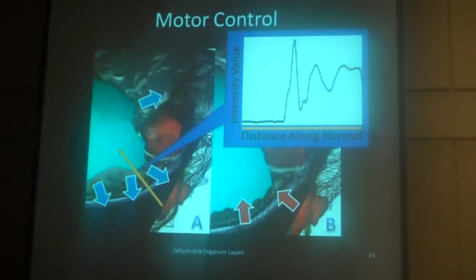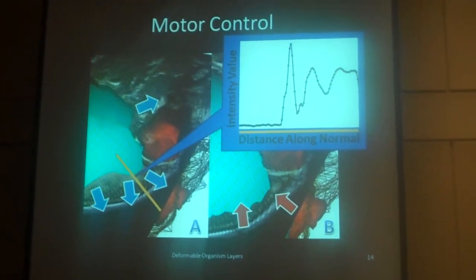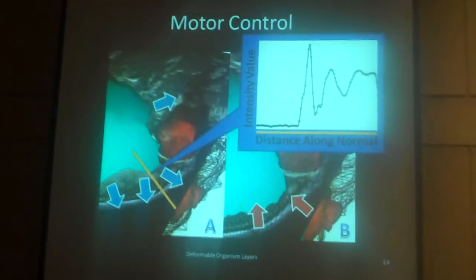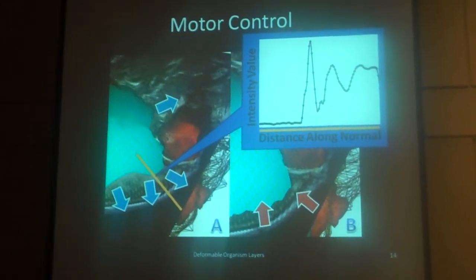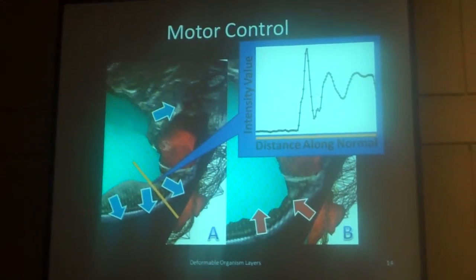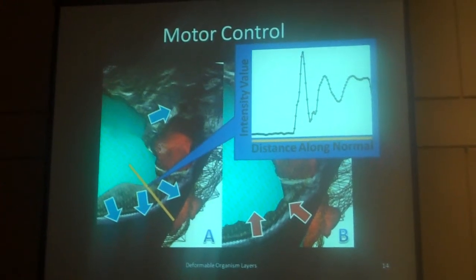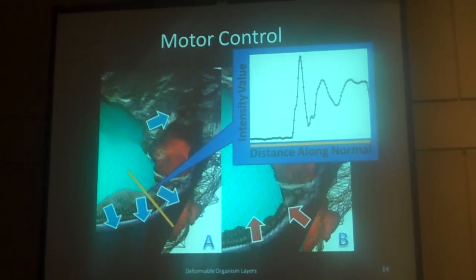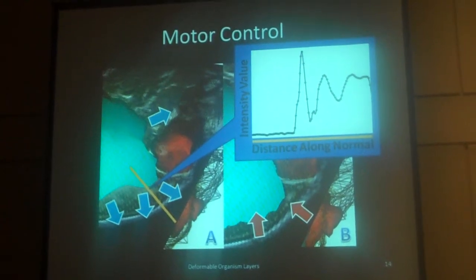The motor control layer dictates how we allow the mesh to deform. In our case, we let the vertices move along the lines normal at the vertex with respect to the mesh's surface. We sample intensities along this line, shown in yellow, from whatever image it's embedded, and this is how we sense the images. This figure right here shows the corresponding intensities from that line. In this particular case, this is from the original T1 image. It starts with the air outside the brain, the spike is the skull and skin, and then it goes into the brain matter.